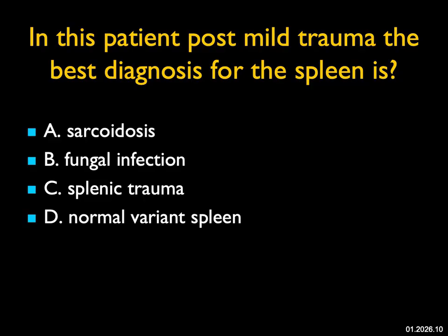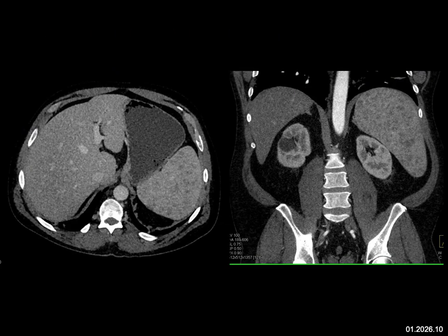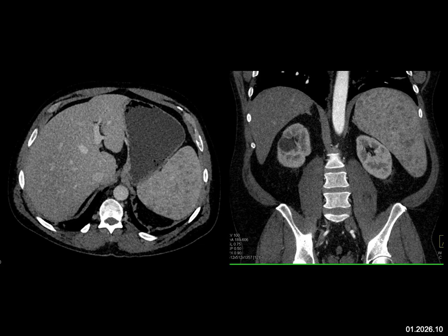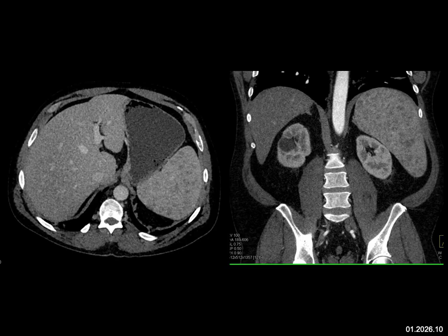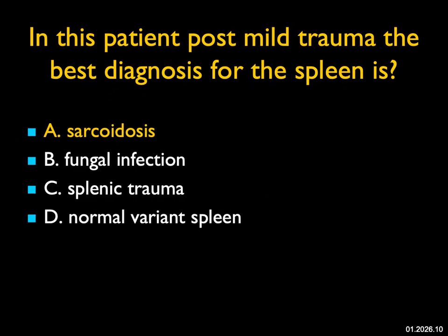In this patient post mild trauma, the best diagnosis for the spleen: the CT was negative except for multiple small lesions in the spleen. In an immunosuppressed patient I would consider fungal infection like candidiasis or aspergillosis. Trauma can give splenic lacerations or hematomas, but that's not the appearance here. This is not a normal variant. This is a great example of sarcoidosis — sarcoidosis can involve the spleen, commonly involves liver and spleen, and can have multiple lesions of variable sizes.